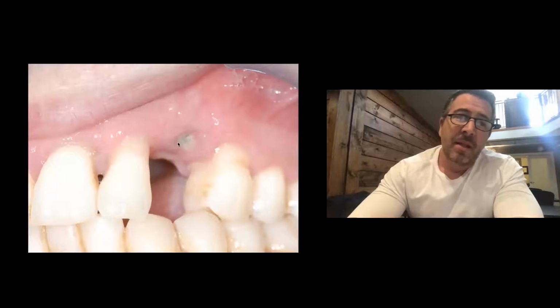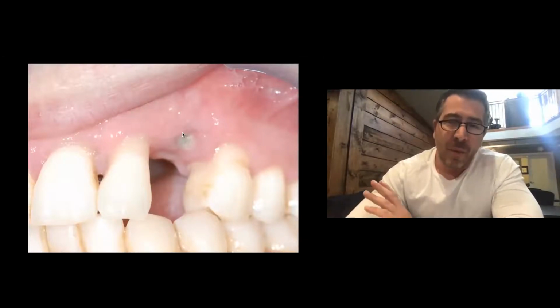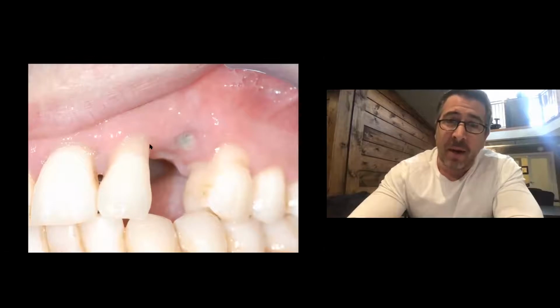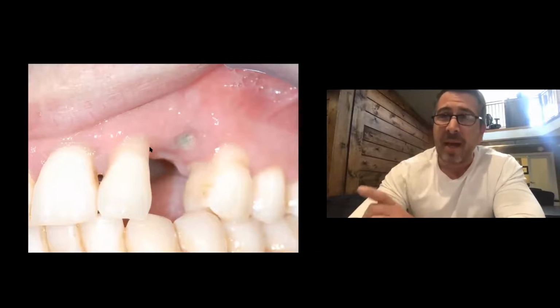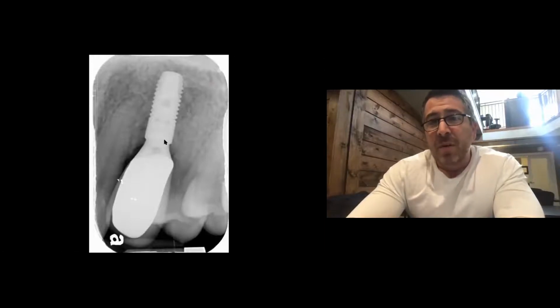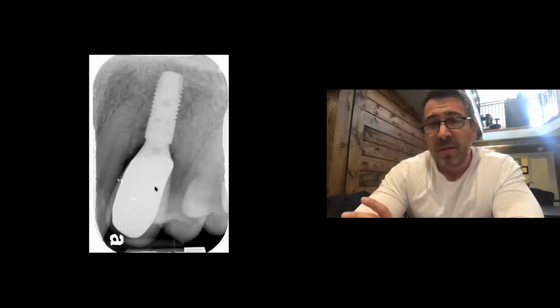So this is after we extracted the tooth, we did a socket preservation on it, we went back in, we did a second round of grafting, and this is after the second round of grafting. But look here, we've lost the papilla. Predictable. It's predictable because what determines that papilla, again, is the interdental height of bone. New implant, its shoulder is pretty apical, so we expect to see a longer crown.